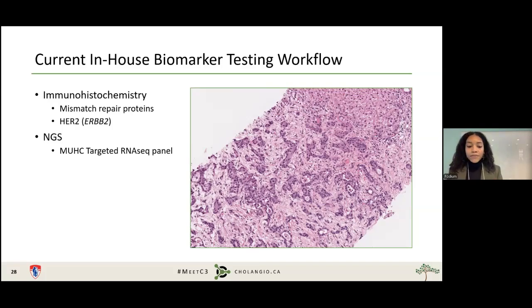If I look at this biopsy, I make this diagnosis, I would reflexively order the RNA-seq panel on this specimen, provided that it's of adequate quality, but also would supplement it with 2 immunohistochemical tests. We do a mismatch repair for microsatellite instability reflexively on these, and we do HER2 IHC. And that's an important thing that I think needs to be understood by patients that do get tested with us, is that they do need to have this complementary test done in their baseline.